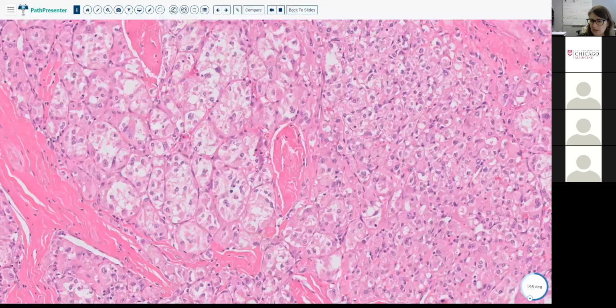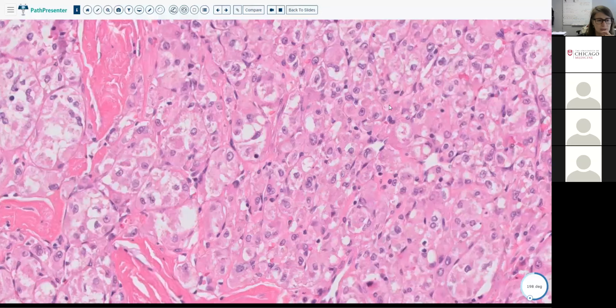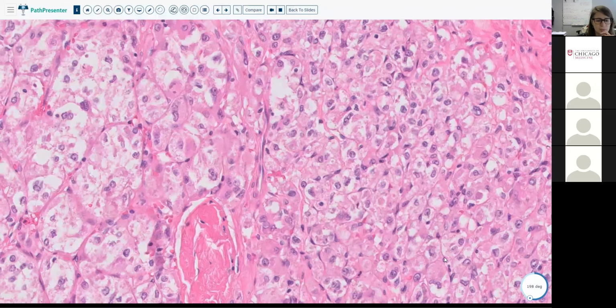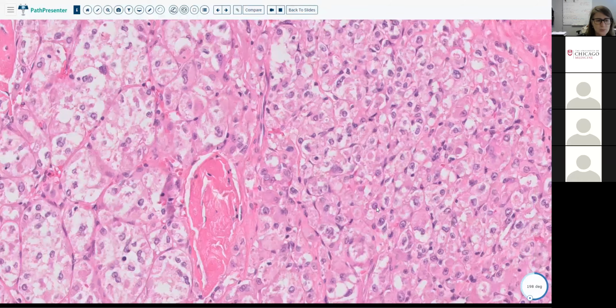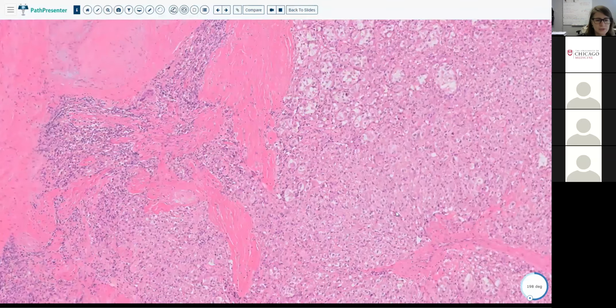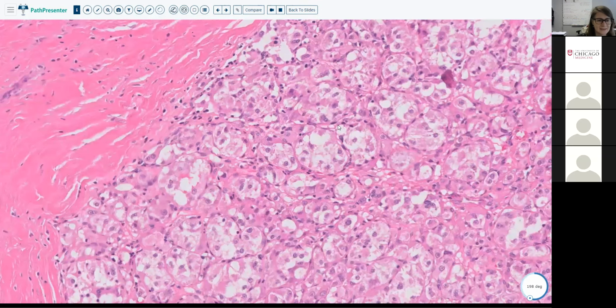And so let me launch the poll. Can you guys see that? Yes. Okay. Probably not everything that you would want to think of is on here. I basically put some of the diagnoses that we're talking about today. But to remind you, this is a nested tumor that has wispy, or one might even say focally granular cytoplasm. The nuclei are large with prominent nucleoli. And so you do want to think about the epithelioid tumor differential, and perhaps the nested tumor differential.